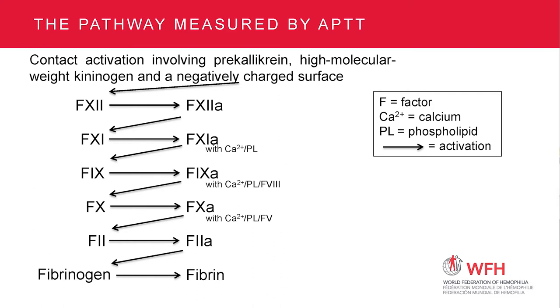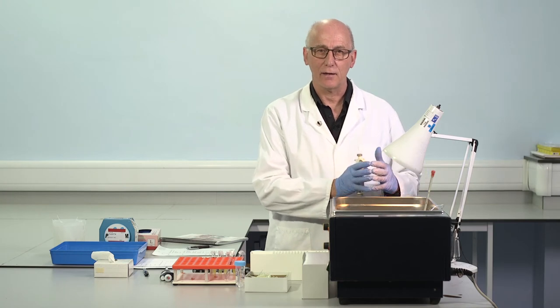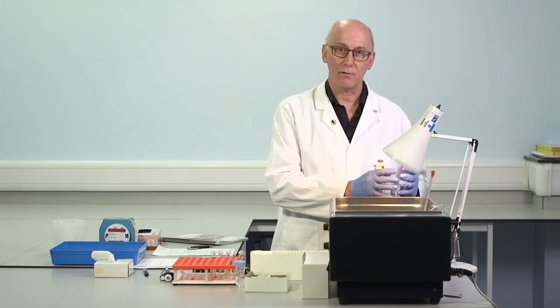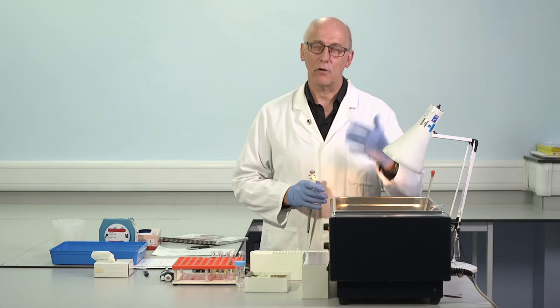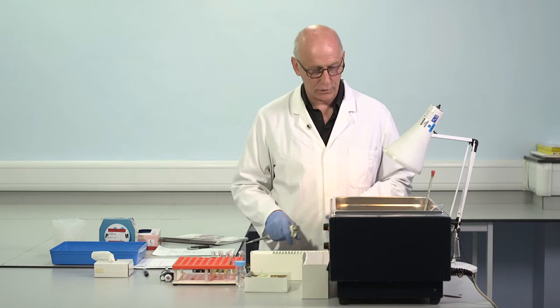The 12A in turn activates factor 11. This is not yet calcium dependent. So we've got 12 to 12A, 11 to 11A occurring in this test tube just now. We'll add some calcium and we'll run through the remaining reactions leading, as you know, to fibrin generation. So longer activation, more 12A, more 11A. Shorter activation, less 12A, less 11A. Longer activation, 3 minutes, more generation. So we're paying careful attention to the stopwatch.